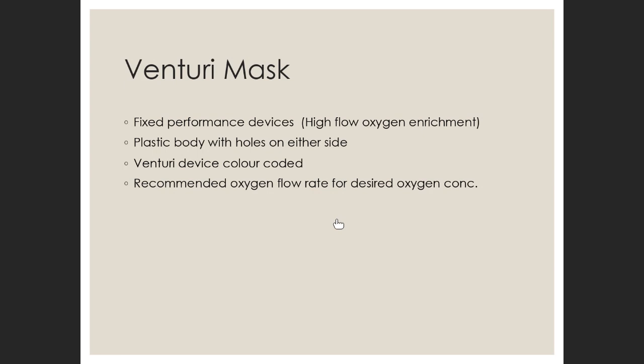Yes, it was 65. So what you do is use a Venturi mask; these are fixed performance devices. They are used when you want to give a precise amount of oxygen. If they are colored, let me see.